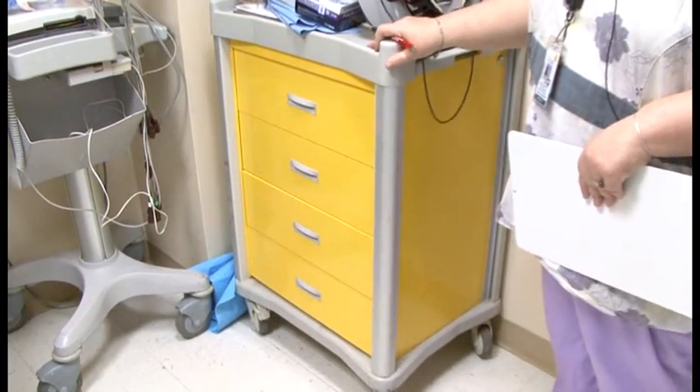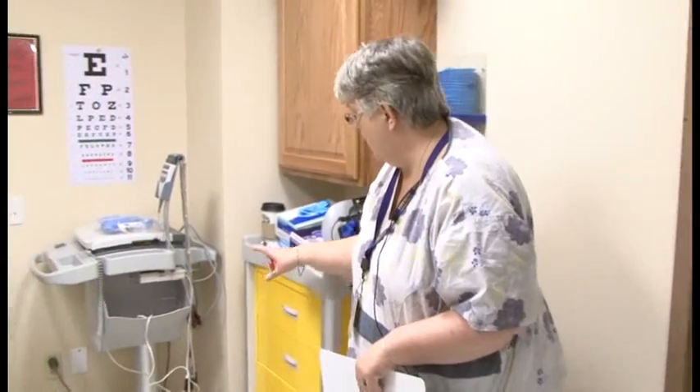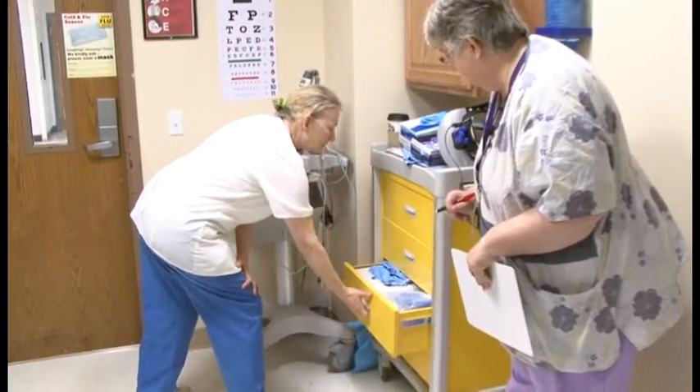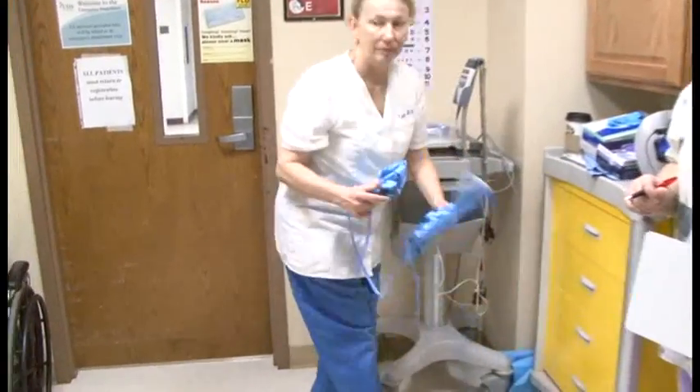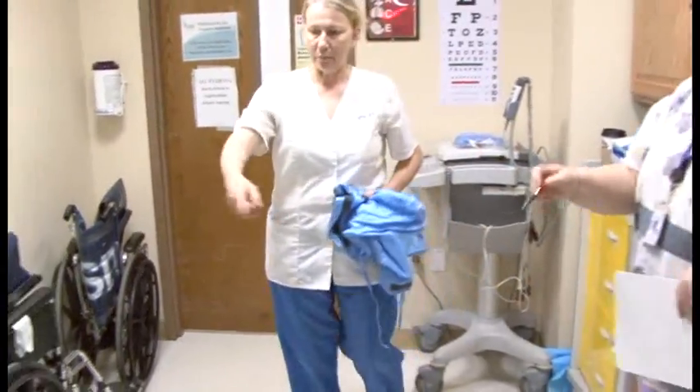This is where all of your isolation materials are kept. Lynn is going to go ahead and grab her disposable boots and put those on — they are the first thing to go on. Lynn, you also need to make sure you have changed into your crocs.